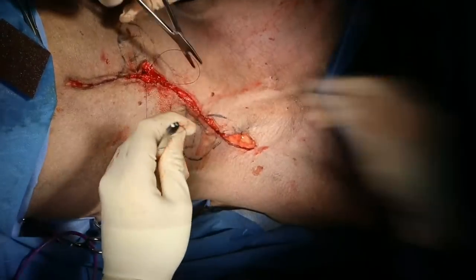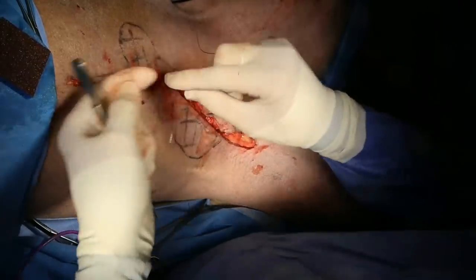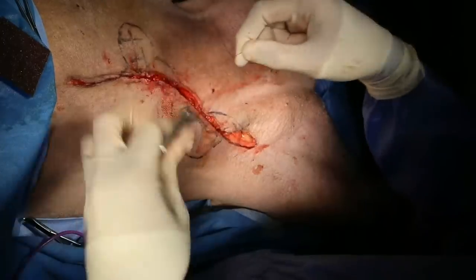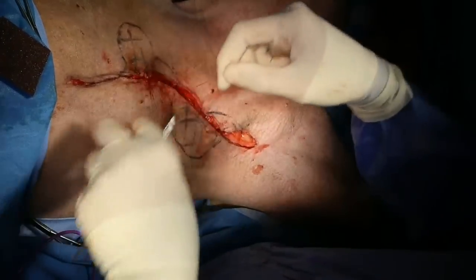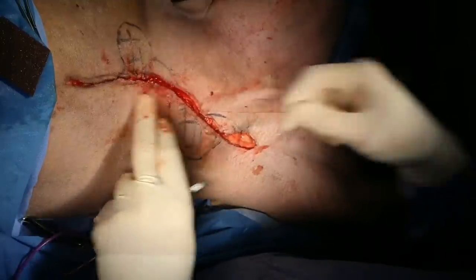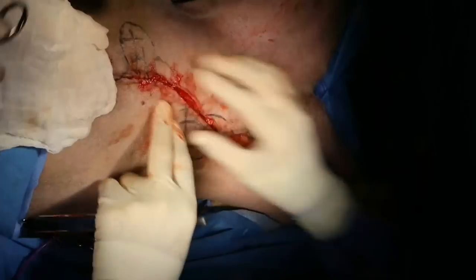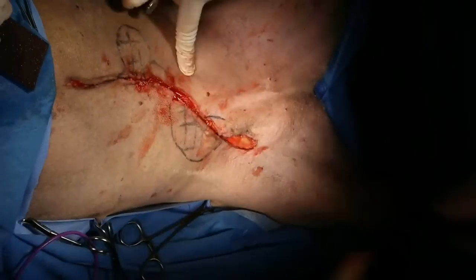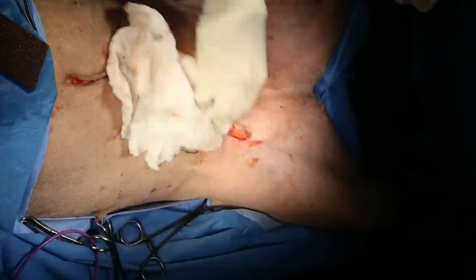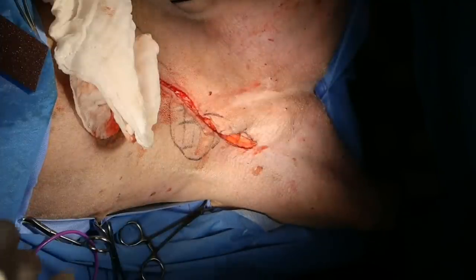I'll just tie off to yours. Staples, Chelsea. I think we'll do intradermal. Okay, Mel's feeling energetic. All right, so that's great. No tension at all. All right, so I'll leave that to Mel to close. You're happy to close that? All right, and I'll just come back over here and see if there are any questions that I've missed.